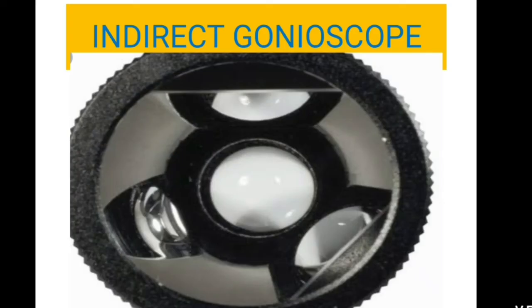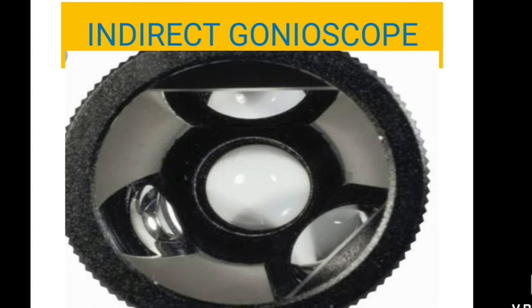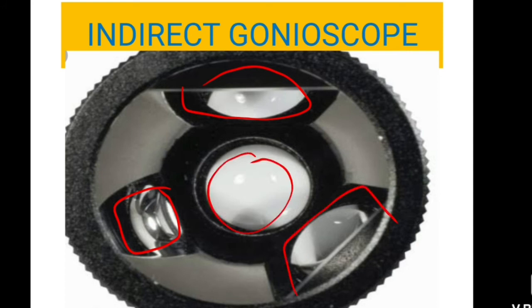So coming to the indirect gonioscopes, we have the prototype, the Goldmann 3-mirror gonioscope. We have 3 mirrors here: the tongue shaped mirror, the square shaped mirror, the trapezoid shaped mirror, and the central lens as well.